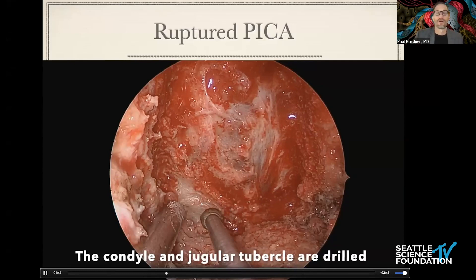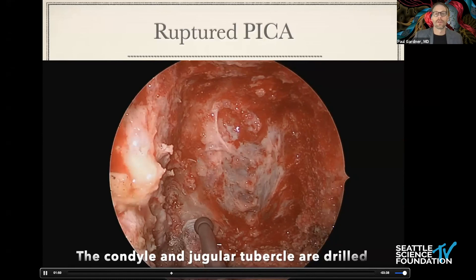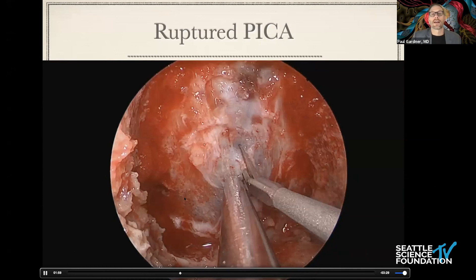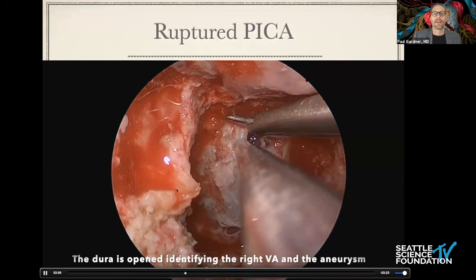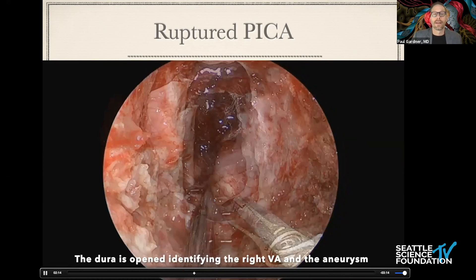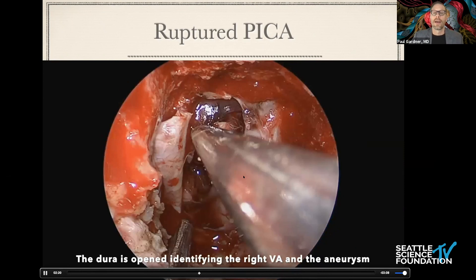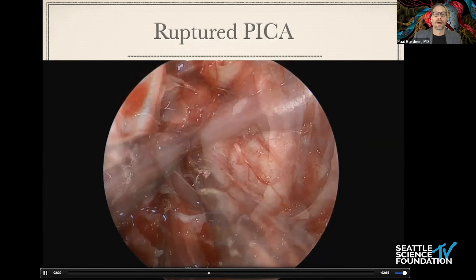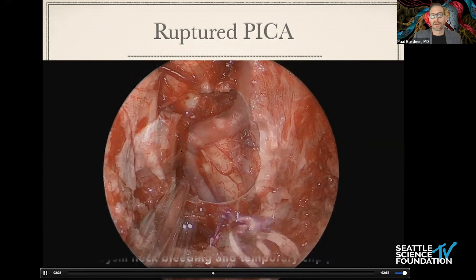By drilling this out, I gain proximal control on the vertebral artery. I need more lateral access for proximal control from a far lateral, and more medial access for distal control here. Now opening the dura very widely — you can see the subarachnoid hemorrhage. I can see the vertebral artery giving rise to this PICA aneurysm. I now have good proximal control on the vert and great distal control on the same vert. The beauty is that I'm preserving flow into the basilar, so I can trap this aneurysm — a very ugly, multi-lobed aneurysm. You can see why they couldn't embolize or coil it.